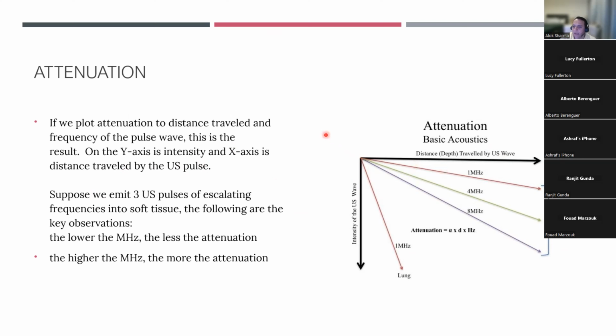But more importantly, with newer machines these days, there are machines where you have to alter the focus to be able to see the superficial areas. Like in the cranial ultrasound, you tend to alter the focus to the level of interest. If I'm trying to look at a more superficial area, I'll change my focus. But actually, if you're using the new GE machines at this particular point, they have multiple areas of focus which optimize resolution.